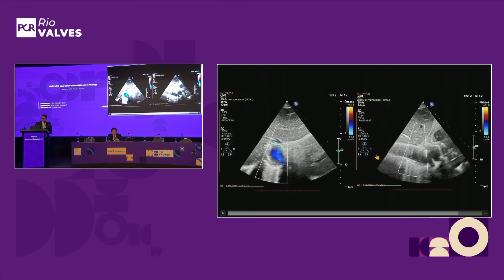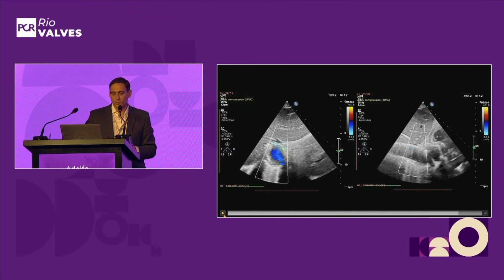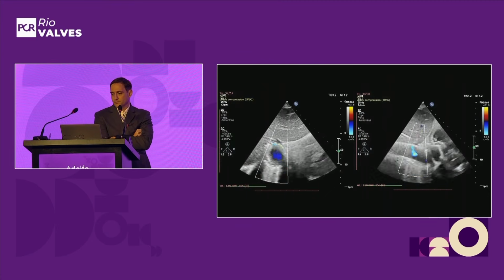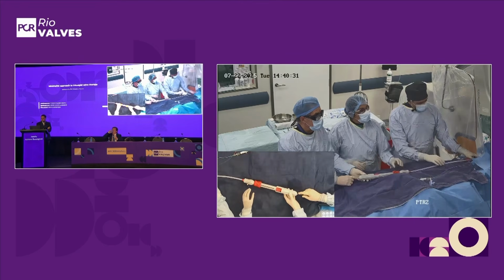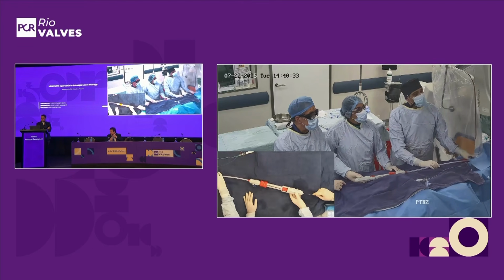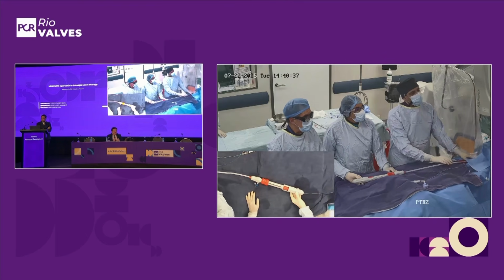You see here, we are taking a look, of course, at the ceiling of the device, but at the distance that we get from the floor of the right atrium to the top of the device. We are happy with the position. So we are going to remove any interference on the valve system, and we are going to check in the echo our final result.